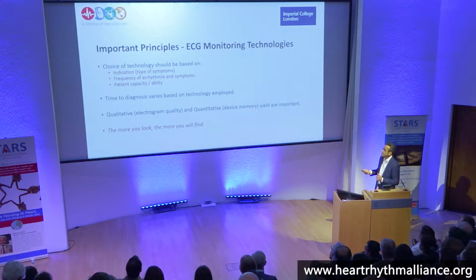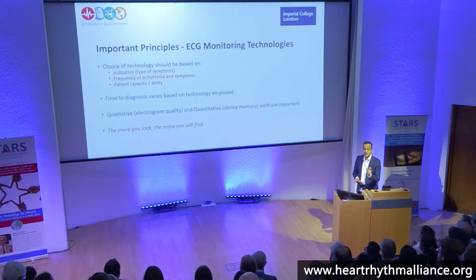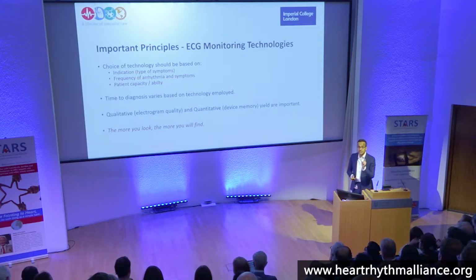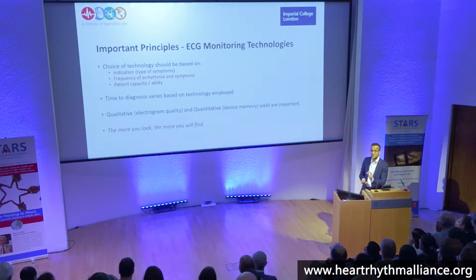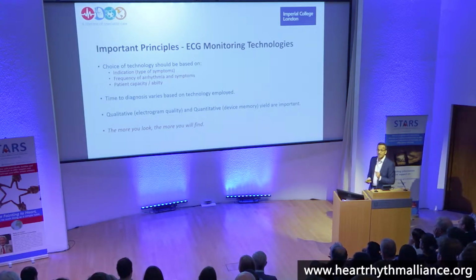The time to diagnosis will be based on the technology that you employ, and that's about getting the right gear first off from the very beginning. If you've got someone with infrequent symptoms, putting a 24-hour Holter on just because the guidelines say that you should do non-invasive, you should do short-term monitoring first, is not necessarily a good idea.